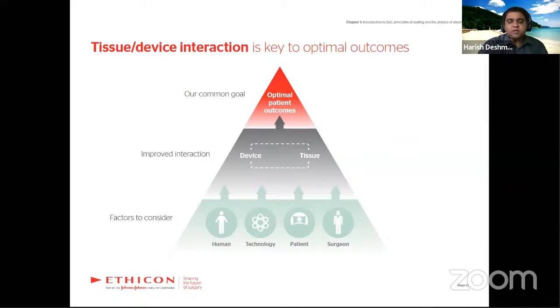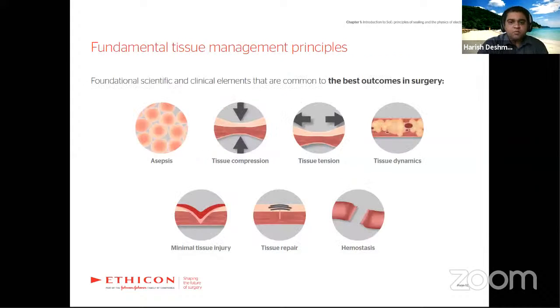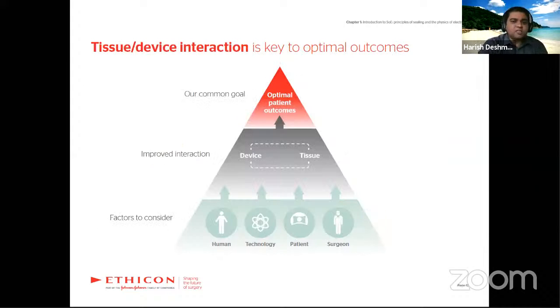When I say human, I mean the patient, his current situation, comorbid conditions and other disease status; then the technology you are using; and the surgeon, how well trained he is to use energy modalities. Procedure-wise, there is never a doubt for surgeons about what the issue is, but when using energy sources the question is always which is the ideal modality or the best way to use it.